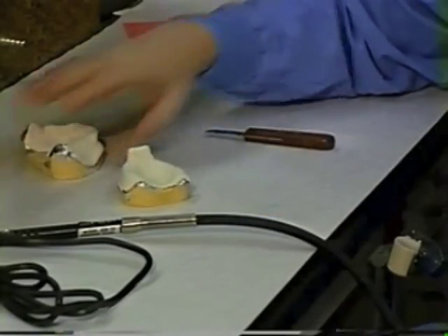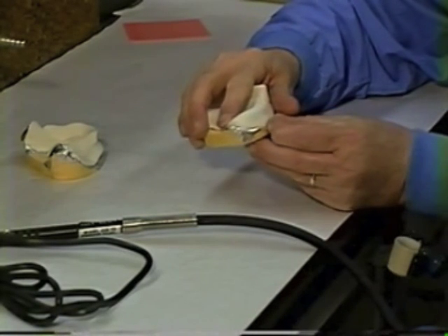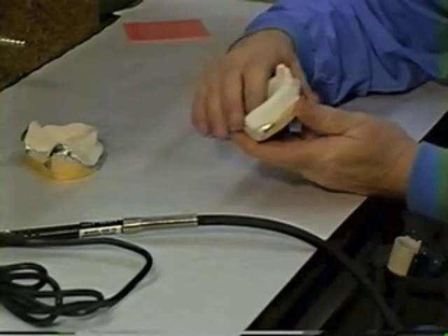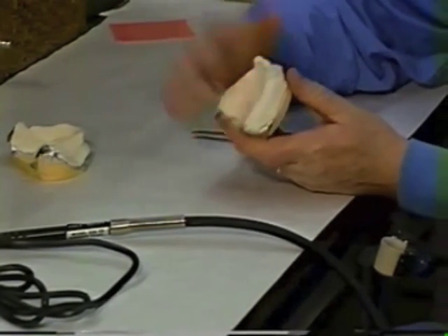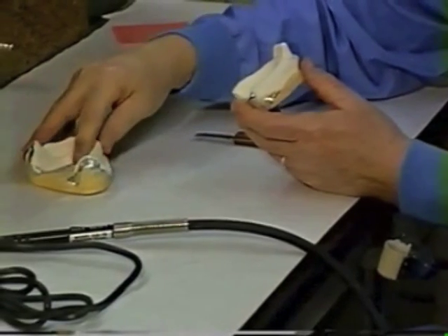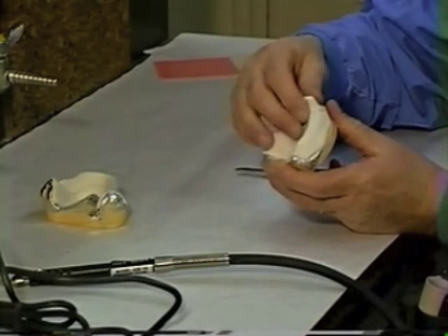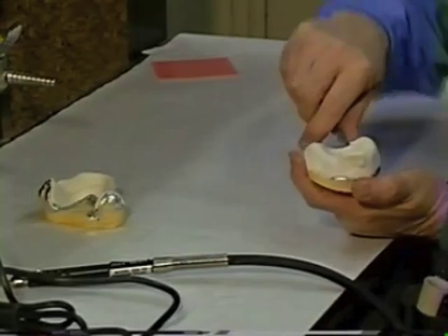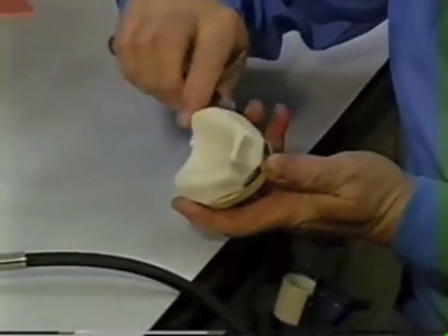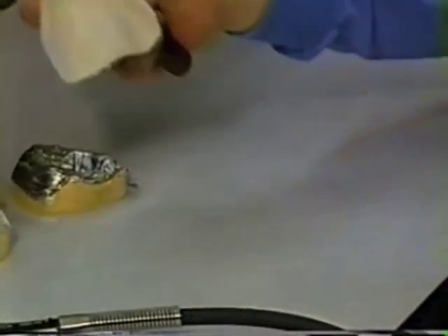After the material has set long enough to complete the polymerization process — you know it's complete when you no longer feel heat on the tray, and while it's still polymerizing you can still feel heat — pry them off the cast. Take a knife, get under the edge, and lift them off. If you're lucky, it all comes off clean.